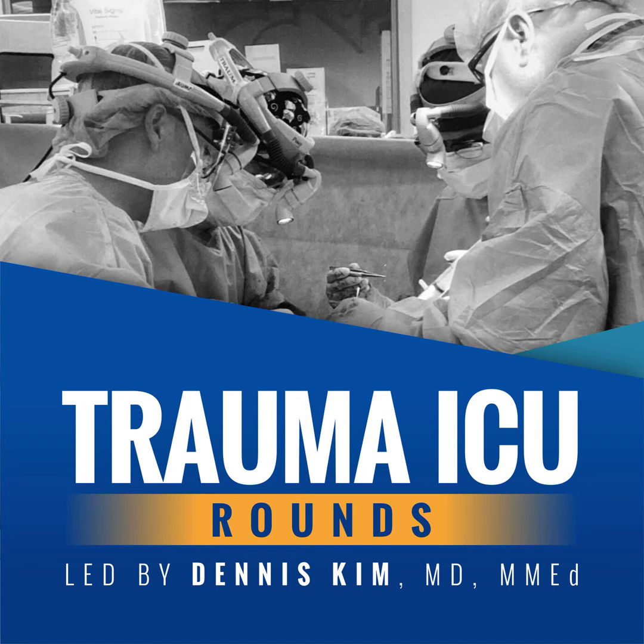Now, compliance is measured in a couple of ways, and you'll oftentimes hear people talking about either dynamic or static compliance. And dynamic compliance is a bit of a misnomer. I say this because it's not truly a measure of compliance. Rather, it reflects the pressure generated to overcome the resistance to airflow, as well as the elastic recoil of the lungs.